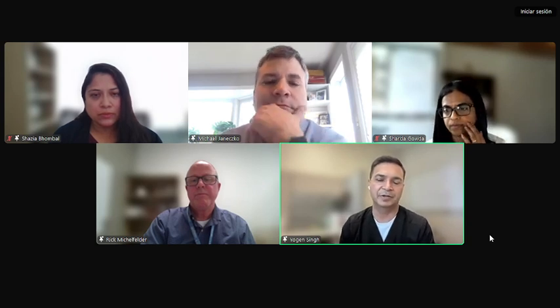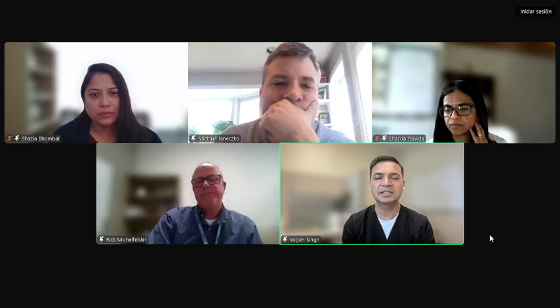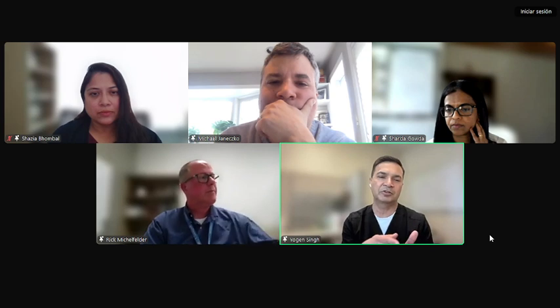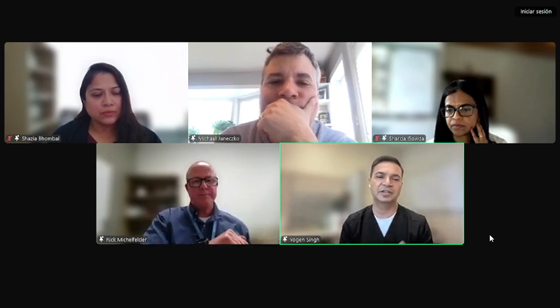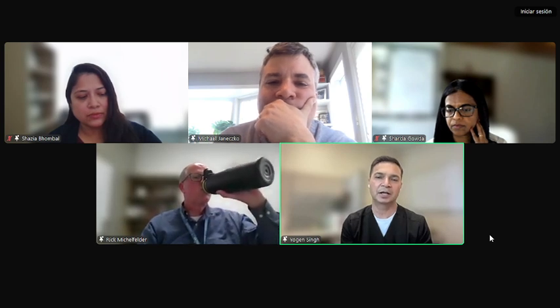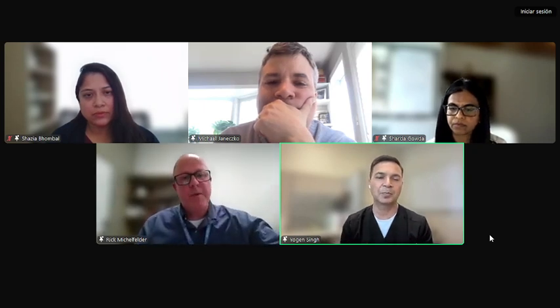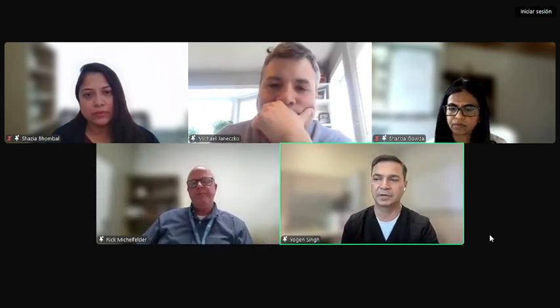And dynamic will be where we're doing the UVC placement under the ultrasound guidance. So I think it's building the skills, a continuum of developing skills. In the beginning, we are training the staff in the normal way we put the UVC lines, and then check with the positions. Gradually, as they become more competent, there'll be a next step towards that as well.